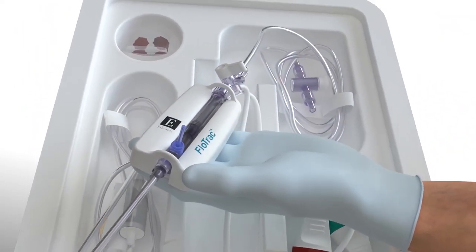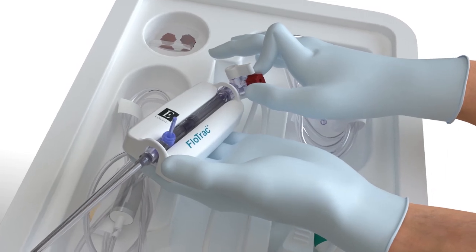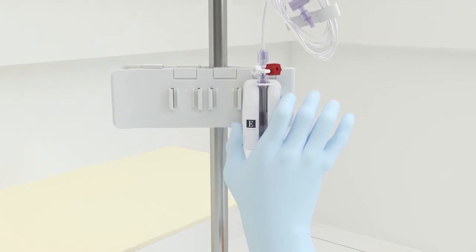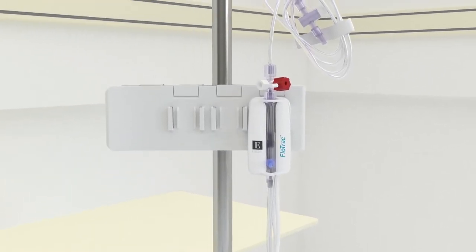Replace all caps with non-vented caps and ensure that all connections are tight. Mount the FloTrac sensor on an IV pole using the appropriate holder.